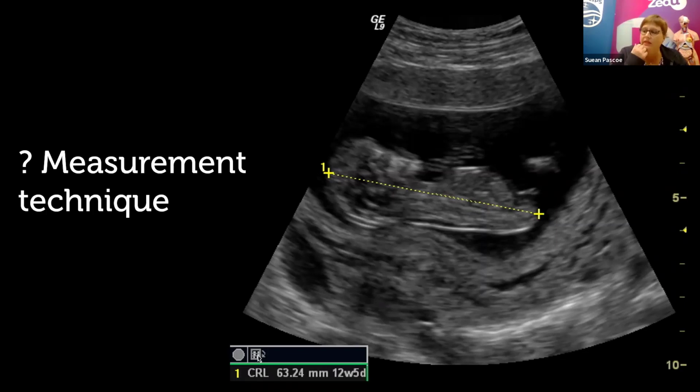The crown rump length here, we want a sagittal picture and we want to measure in the midline. So, are we in the right position in the first place to take the measurement, and then where are the calipers placed? Are they accurately positioned?